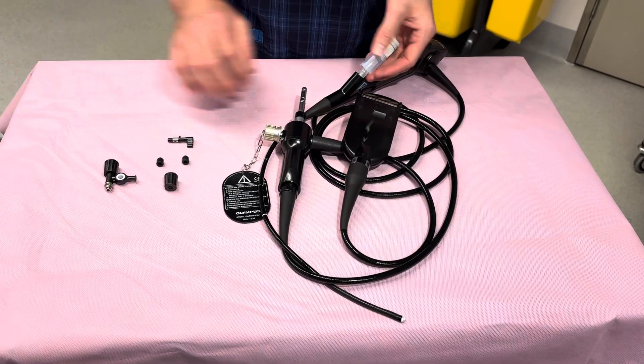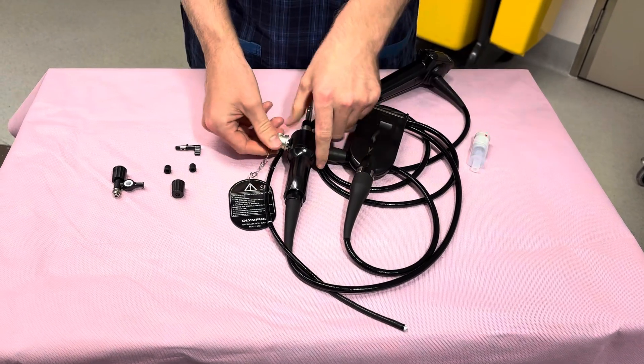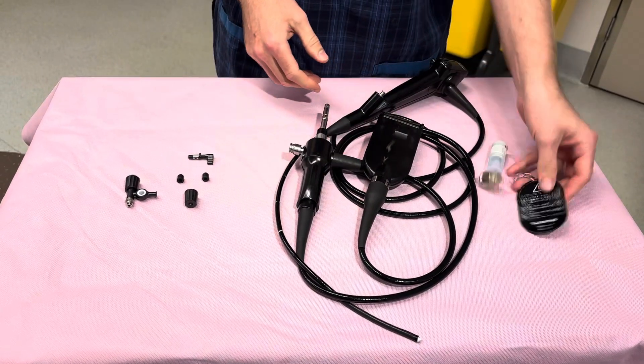Step one is to remove the booster, which pops off like that. Step two is to push and twist and take the sterilization cap off.